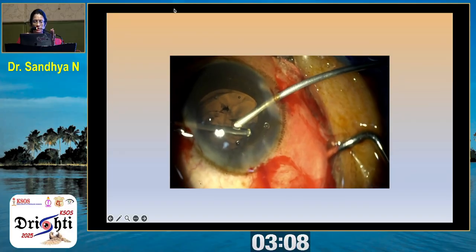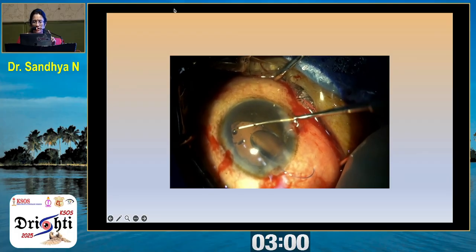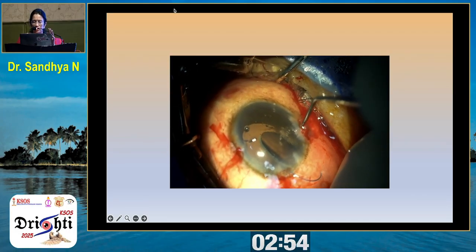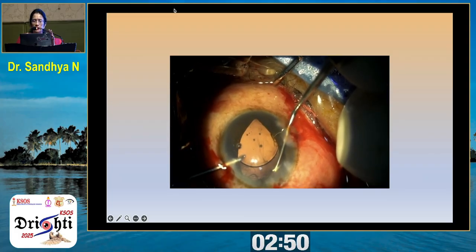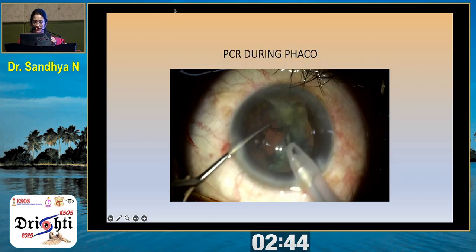And after a good vitrectomy, you can see there's a slight enlargement of the posterior PCR. And so we have got a rexis extension plus a PCR. But still there was adequate rexis, and the posterior capsule was good enough. So a 3-piece lens was placed in the sulcus, and the optic was captured under whatever rexis was available there. We had a good overlap of the rexis.